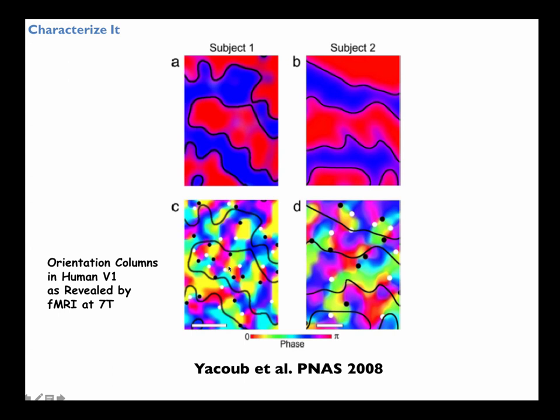So while it's not clear whether this is real or not, it's compelling, but at the same time, it's potentially easy to create these maps, believe it or not, by not being careful about how you interpret your processing. Anyway, that shows the very bleeding edge in terms of columns, in terms of what the resolution is. And it's still controversial right there.